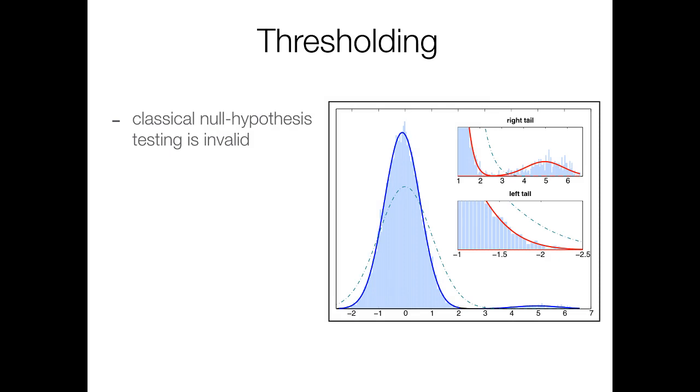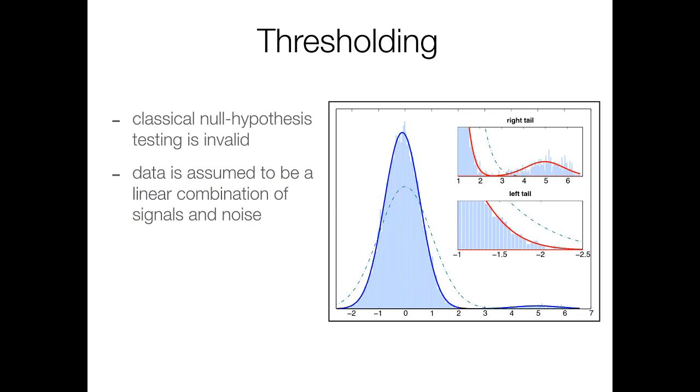So the distribution of a component spatial map will typically look something like this. We can see a large peak centered around 0, which contains all of the voxels which did not contribute very much to the component. But there is a smaller peak off to the right containing high values, and these are the ones which contain interesting voxels that form most of the signal in this component. And hopefully you can see that because this is not normally distributed data, we can't use a standard statistical test like a t-test. Instead, we need to do something a bit more advanced called mixture modeling.